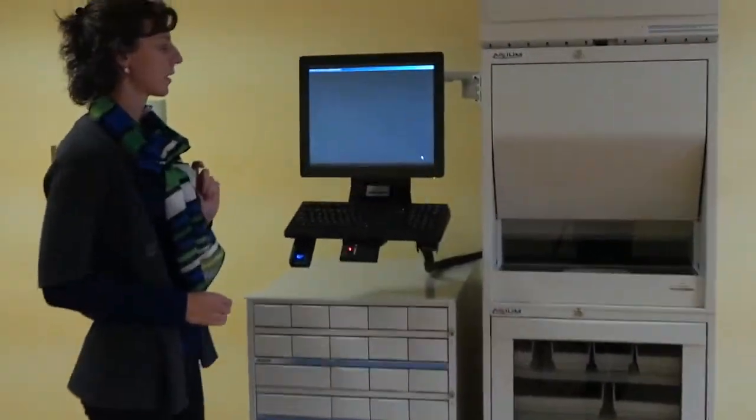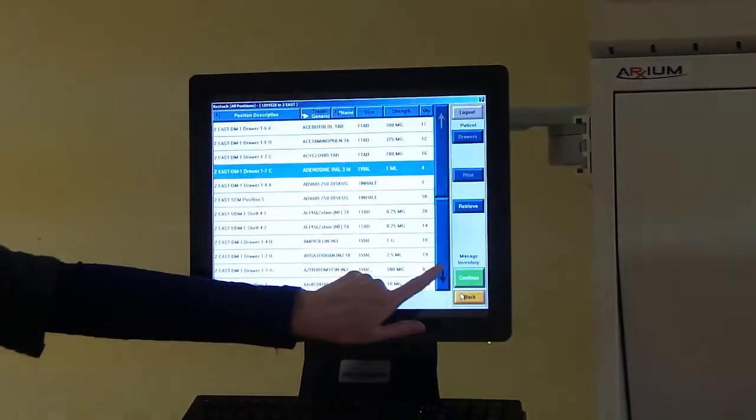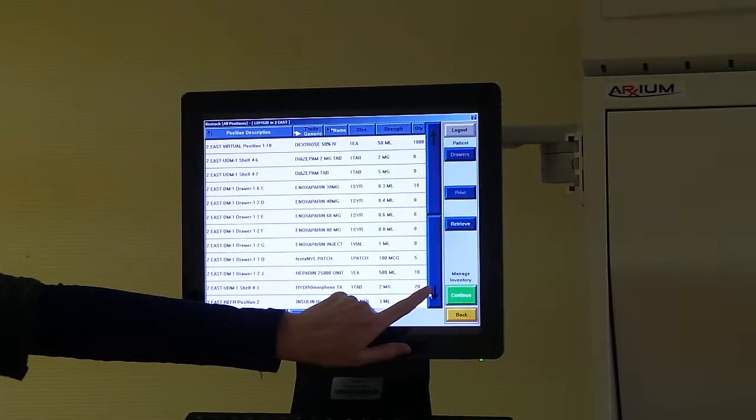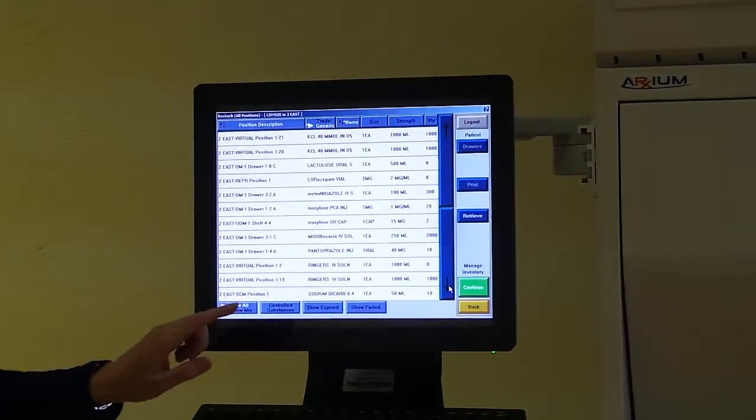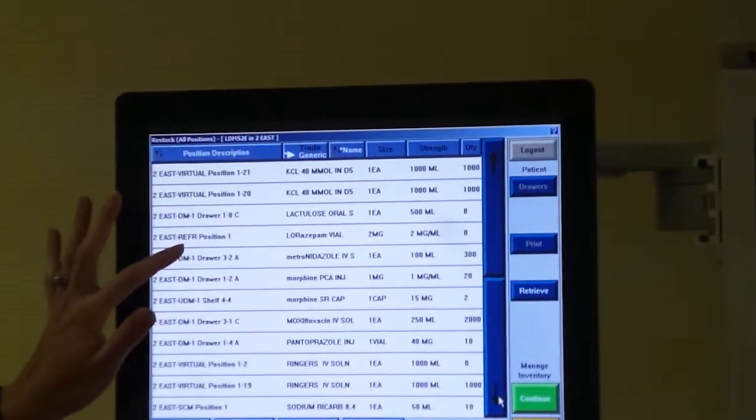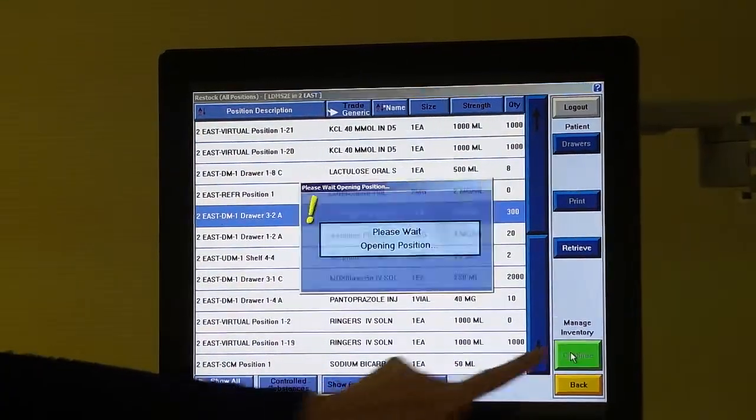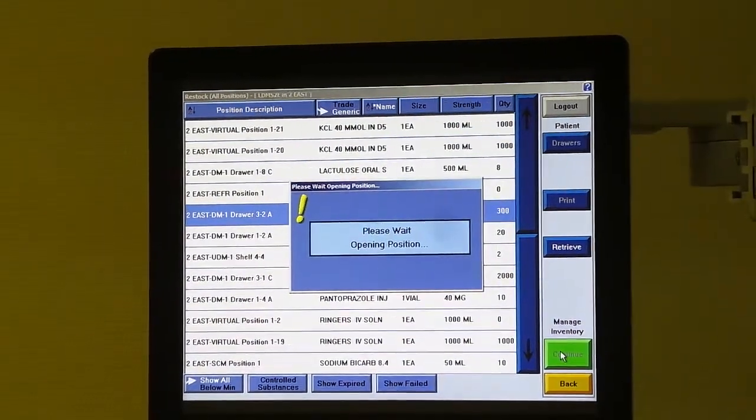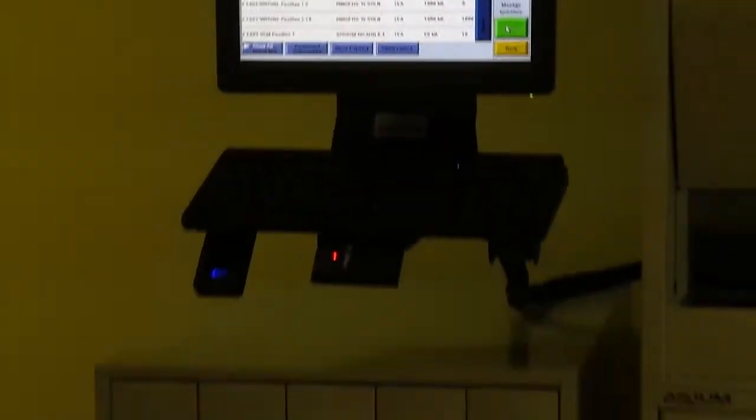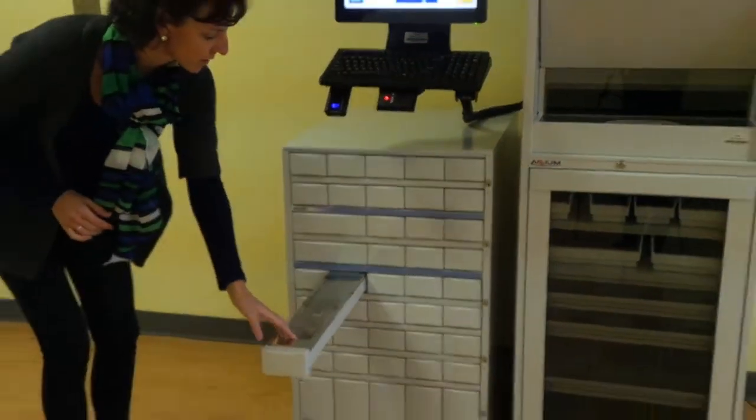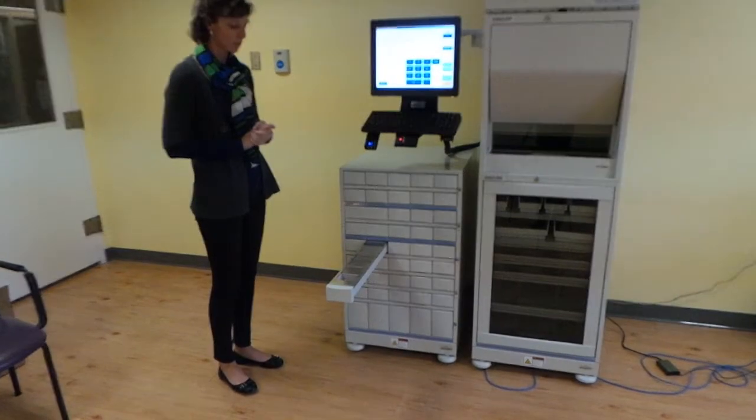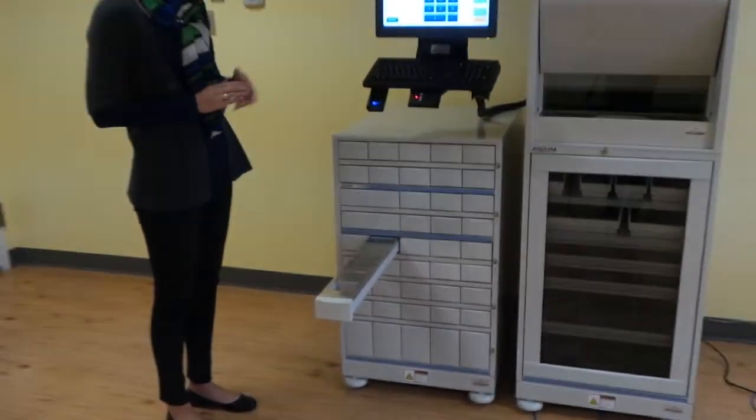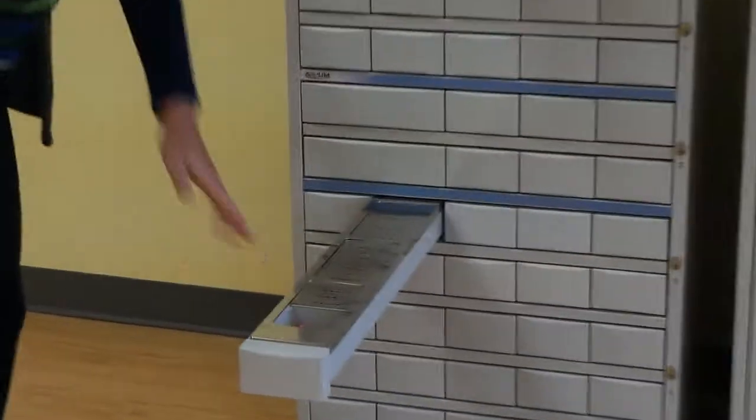The second type of drawer is a single-item access drawer. This is primarily used for narcotics and controlled substances. What will happen is the drawer will open and there will be a sheet of metal over the types of medications you are not permitted to access. Only the medication that you are trying to dispense will be available for you.